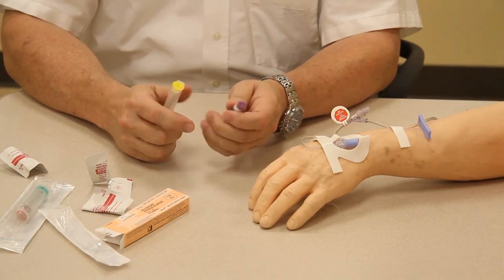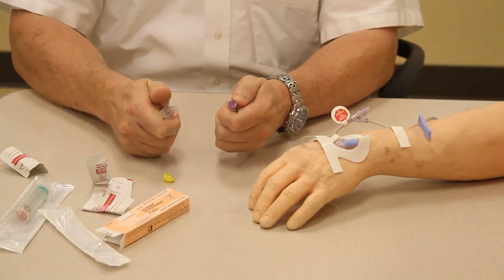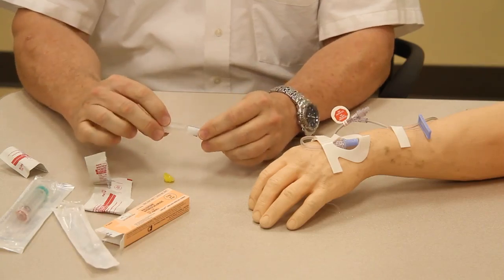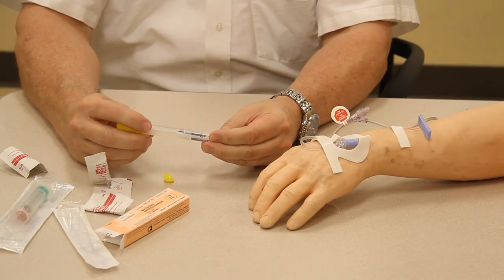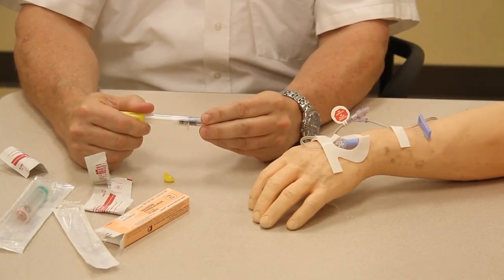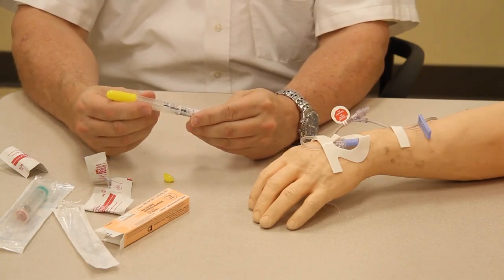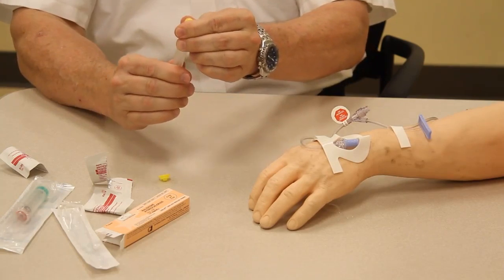Now what we want to do is pop the cap on the syringe and pop the cap on the medication. Then we're going to push the medication in and twist. And once we have twisted as far as it will go, we're going to pull the medication up. I'm going to take off the cap.